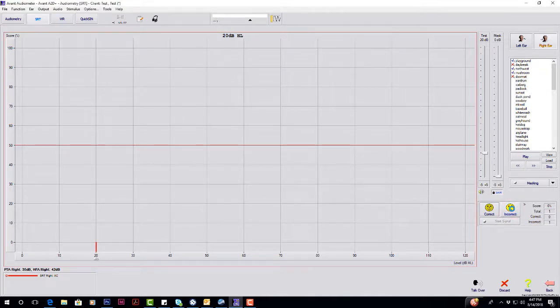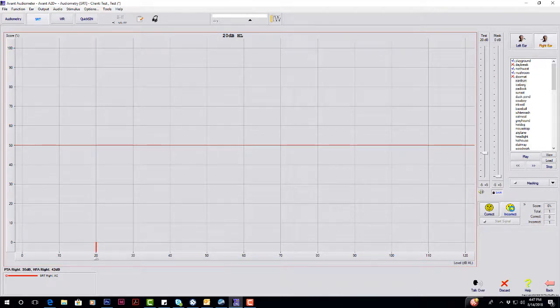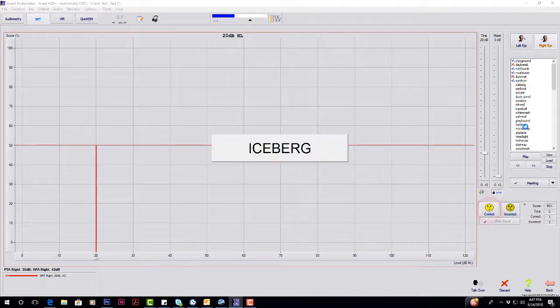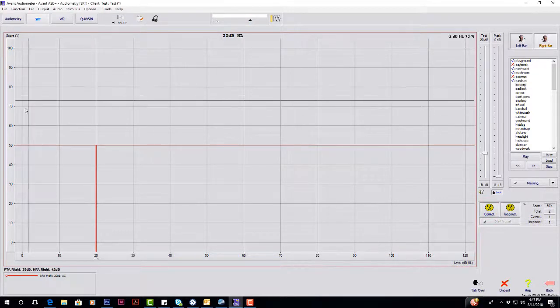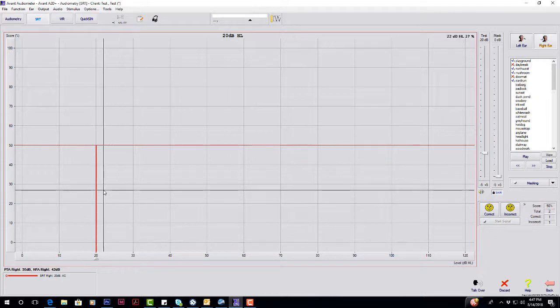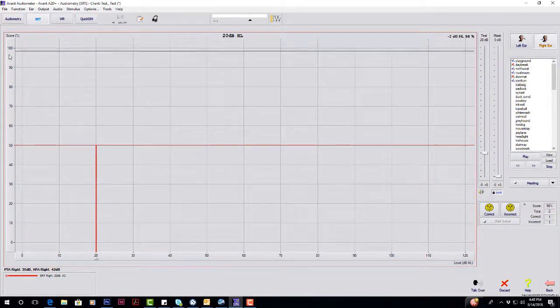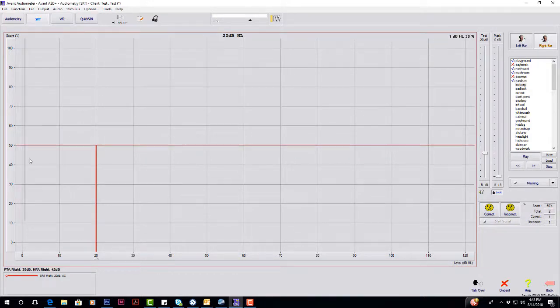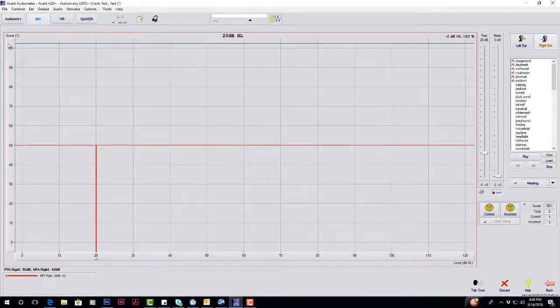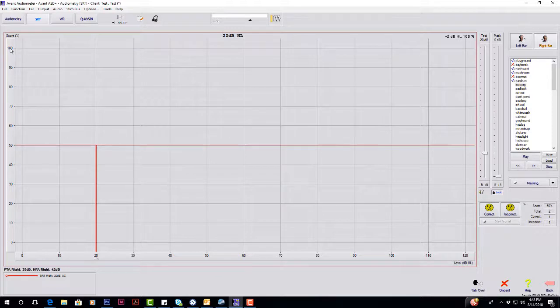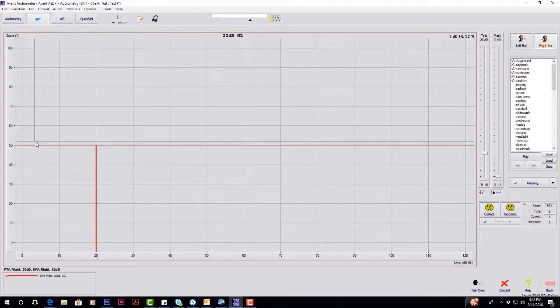So depending on your preference, you'll just have to really play with it. Looking at the graph here, the vertical is going to be your score and percentage, 100%, and then the horizontal red line is your 50% line.